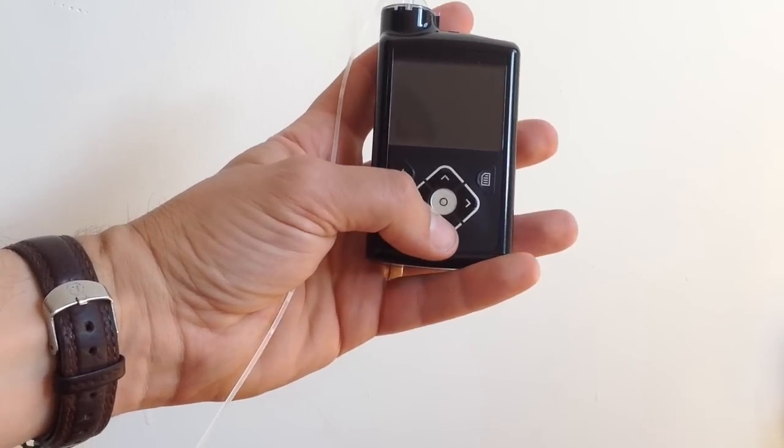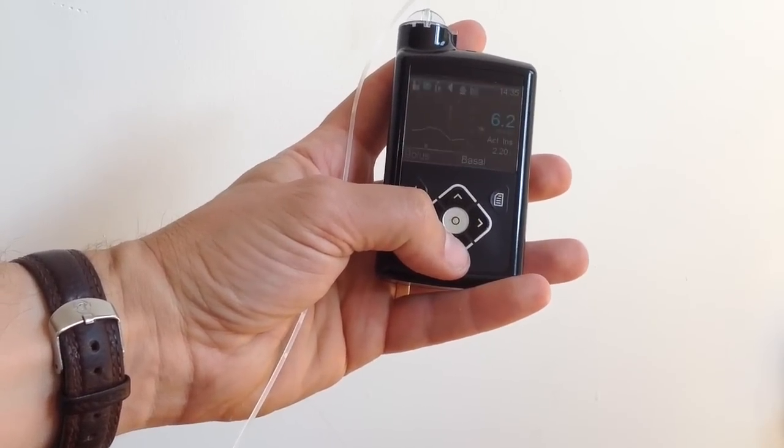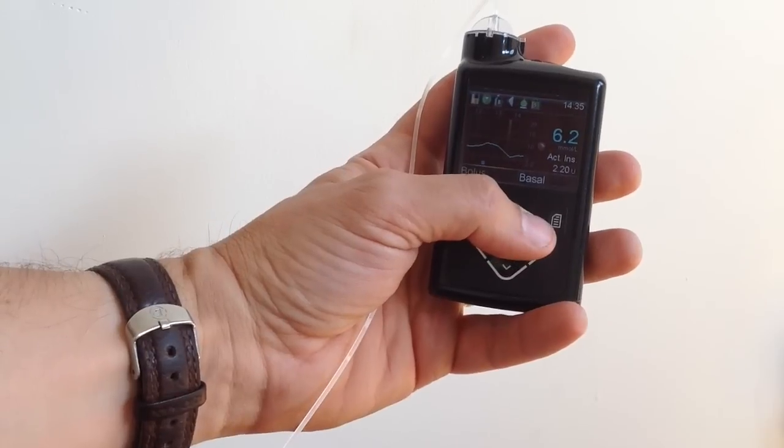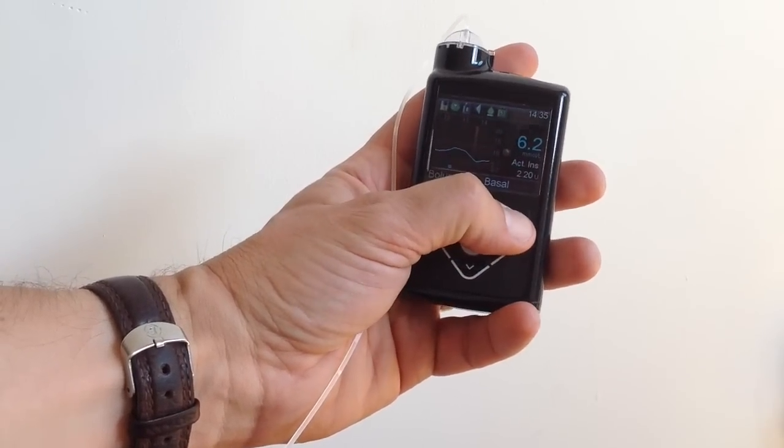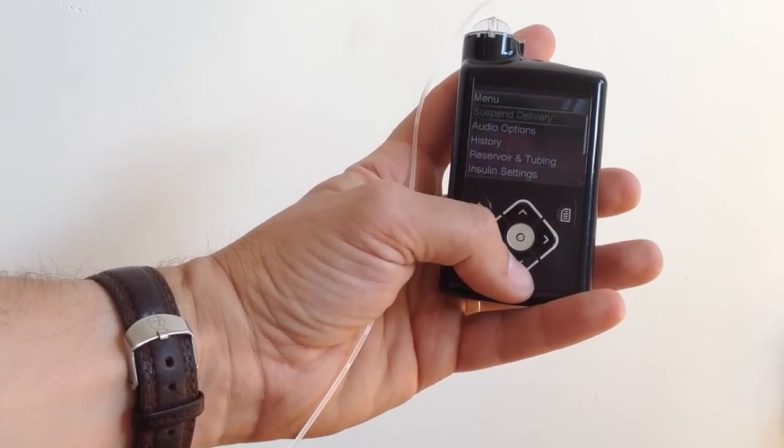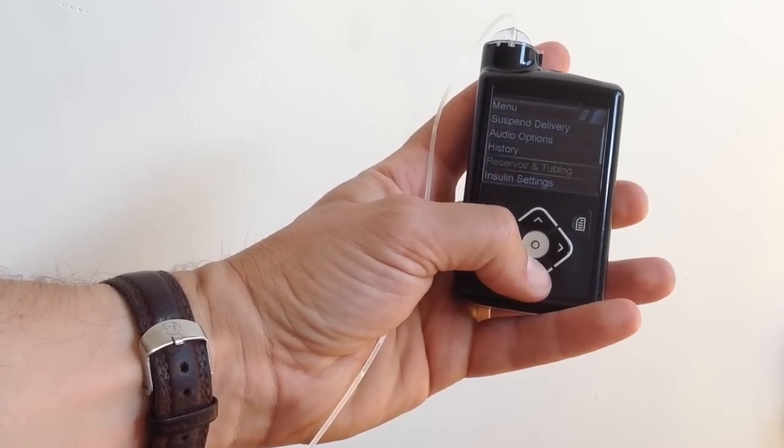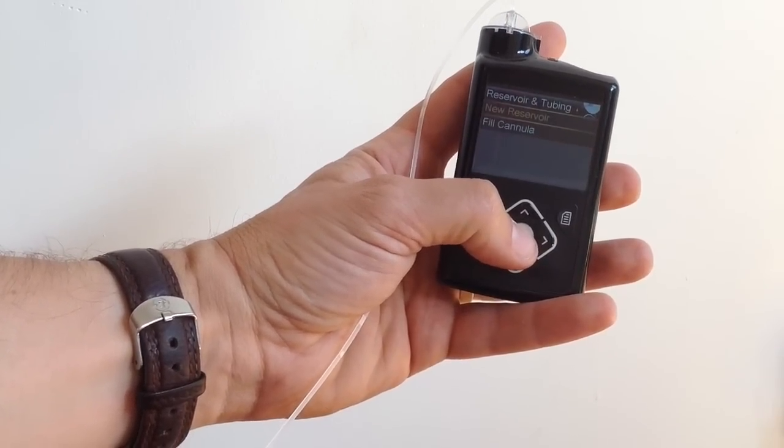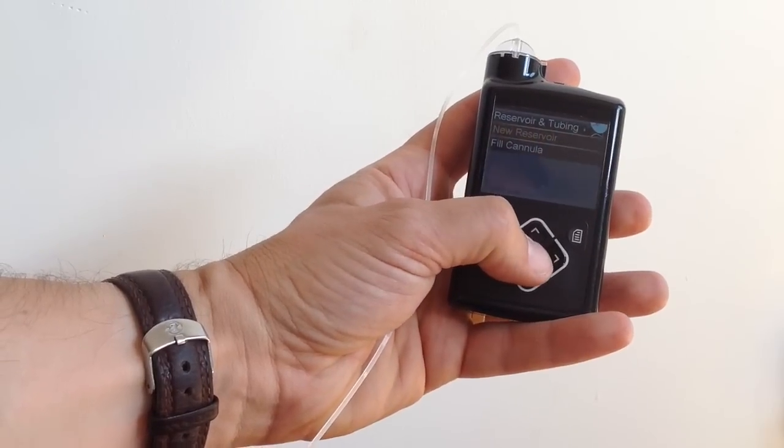So, here we go. Right, let's start. So first of all, you just go into the screen there, and then on the menu button, over here, you go down to reservoir and tubing. And then you select the new reservoir.